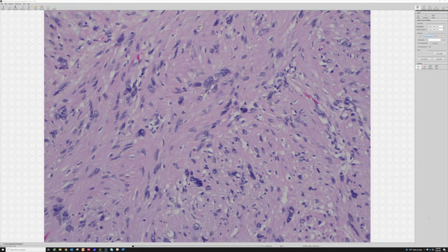And in fact, you can see it in other nerve sheath tumors too. Neurofibromas tend to have this sometimes, especially in patients with neurofibromatosis 1. They can get some pretty bizarre scattered atypia. And then there are times where there's this kind of intermediate thing between neurofibroma and malignant peripheral nerve sheath tumor that's called atypical neurofibromatous neoplasm of uncertain biologic behavior, I think, ANNUBB. I can't remember the abbreviation. I'll put the link down below.